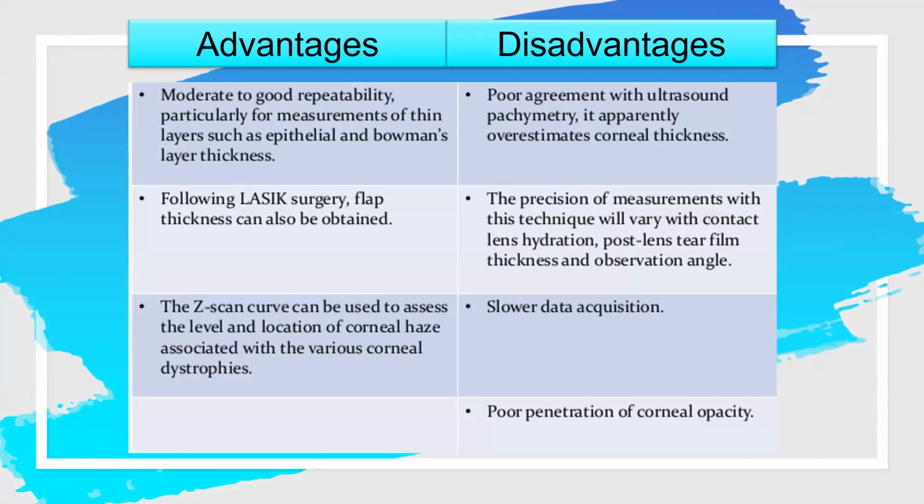About this test, it can look at the location of the opacity and the corneal thickness also. Although some poor agreement has been there with ultrasonic pachymetry, the precision is good.